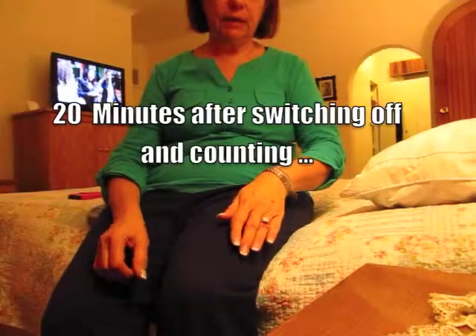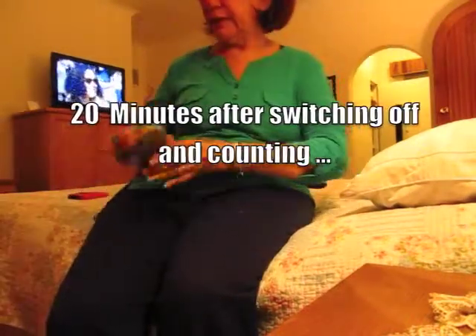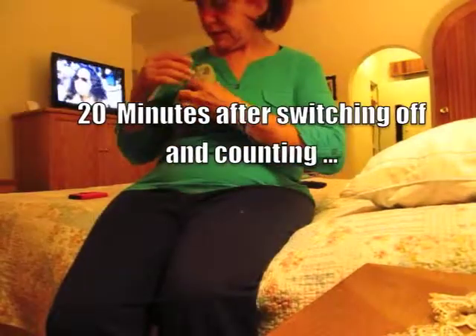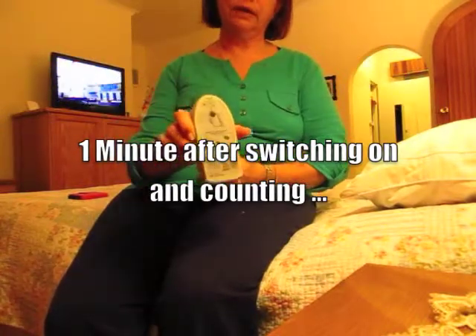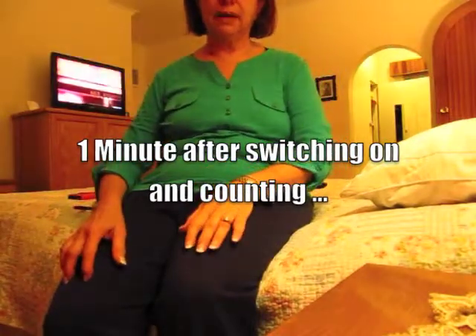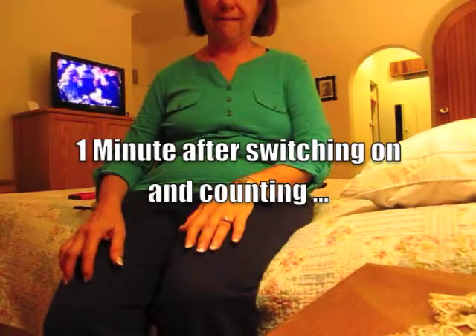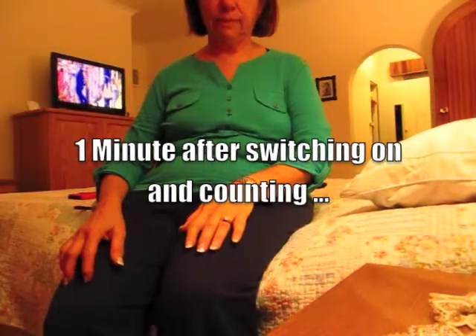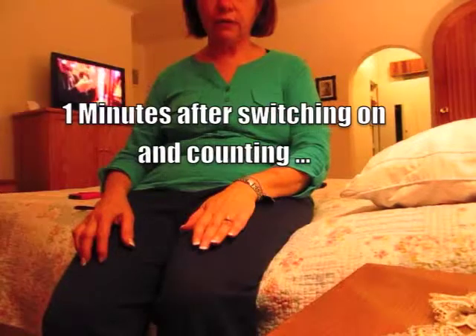I'm going to switch myself back on now, and take the left side right down as far as it'll go. There we go, it's on. The pins and needles — my God. Now that was terrible. I can hardly speak now. My speech is now a lot worse.